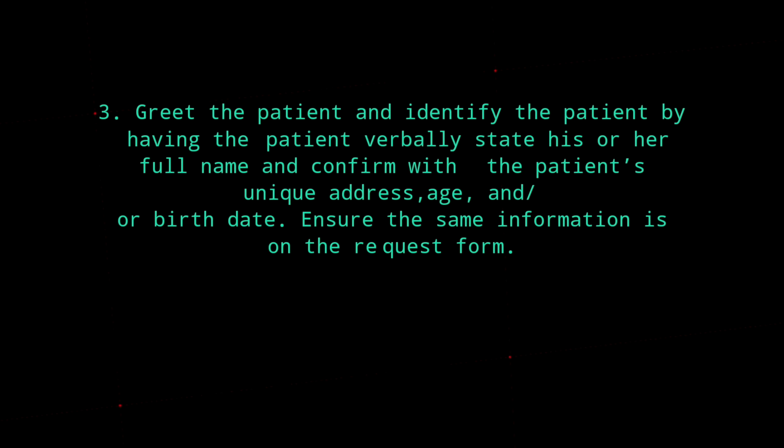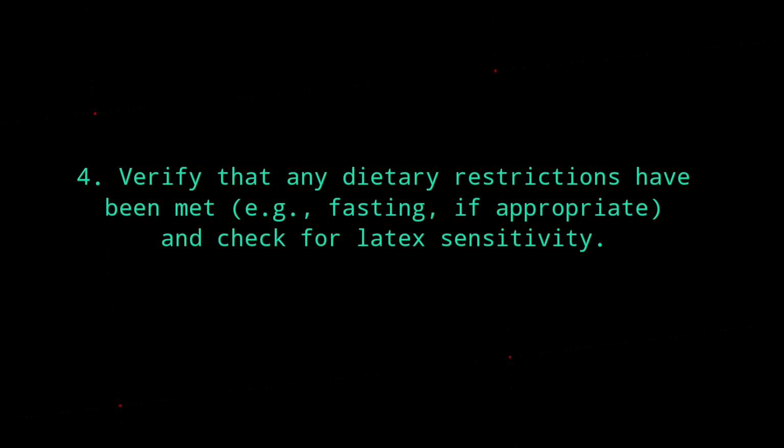And confirm with the patient's unique address, age, and or birthday. And ensure the same information is on the request form. Dapat siguraduhin mo na magkamukha yung sinasabi ng pasyente sa iyo and dun sa nakalagay dun sa request form ng ating pasyente. Next is to verify that any dietary restrictions have been met.